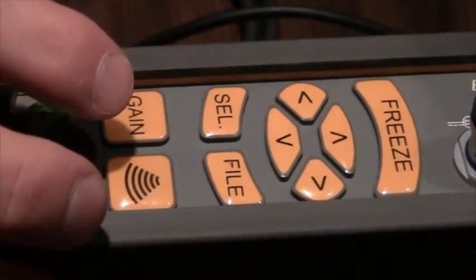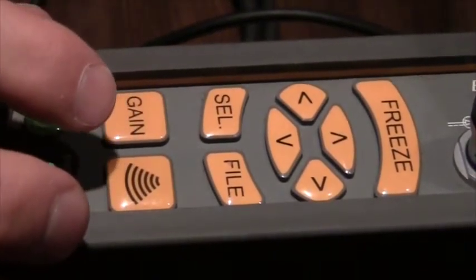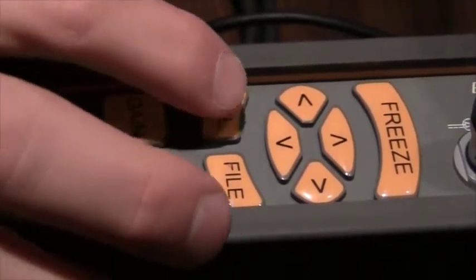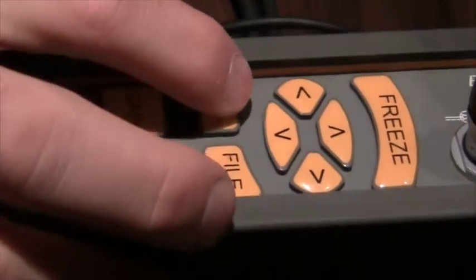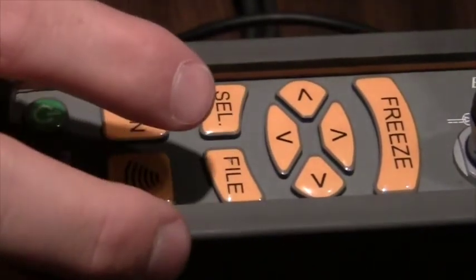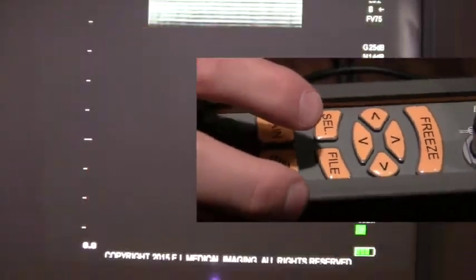To adjust settings on the IBEX light from a live image, hit the select key. This brings you to the internal menu.